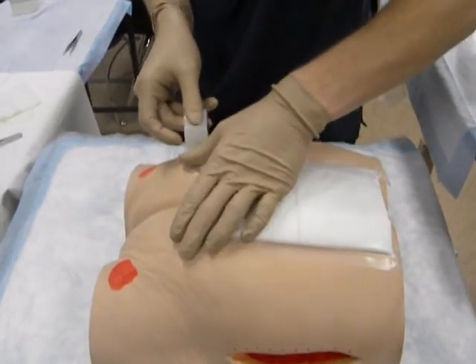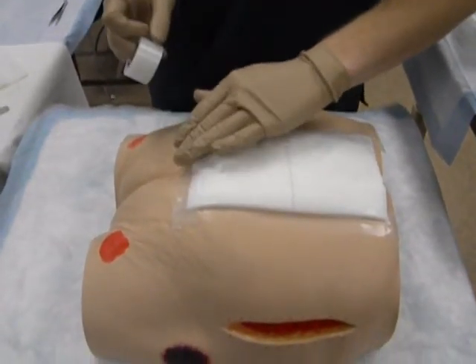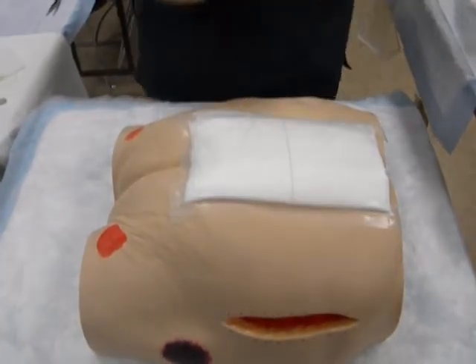And using the appropriate tape choice to secure your final abdominal bandage over your stage 3 pressure ulcer.